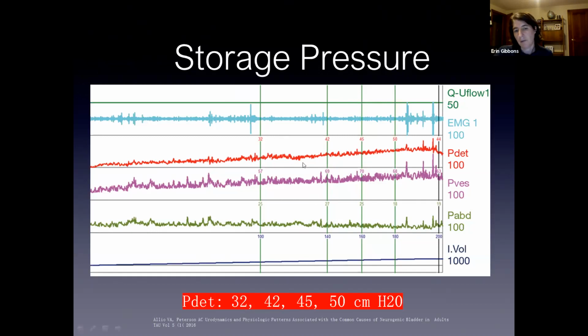So I would mark in my dictation that this person has a persistently elevated detrusor pressure above 40 centimeters of water, and that's going to put their upper tracts at risk. But you don't actually have to sit there and calculate out, you know, 200 milliliters in, 50 centimeters of water and change, a compliance of 4, because I don't think anyone actually uses that number. It's really the detrusor pressure consistently above 40 centimeters of water, putting the upper tracts at risk.